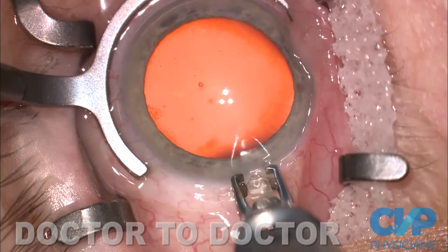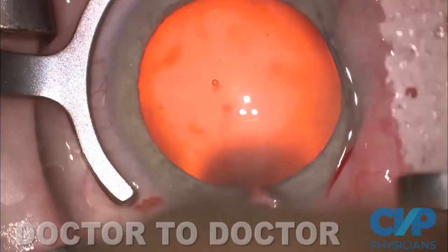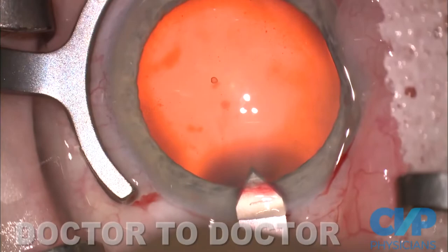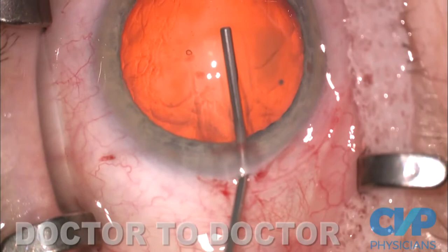I believe that the incision is so important, and I like a three-plane incision. I make a groove and then an uphill tunnel. Once I've made my tunnel, I insert a keratome and make a third plane — a carpenter's lap joint — which flares the incision. So it's 2.2 on the outside, 2.4 on the inside. Then I fill the eye with Helon 5.